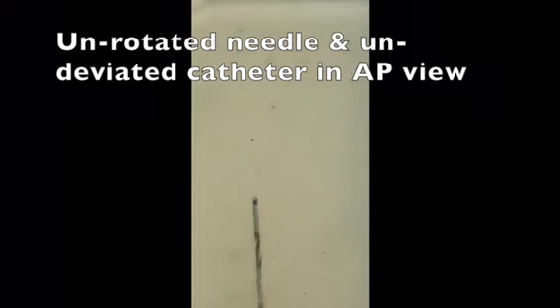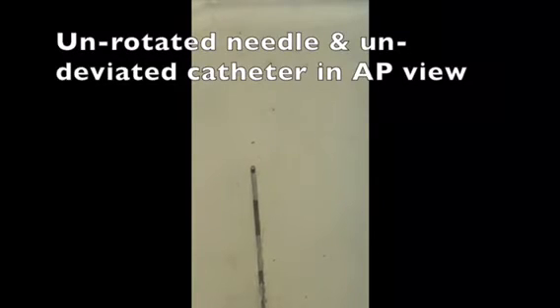I advance the epidural needle until I find the epidural space by using the technique of loss of resistance to normal saline. Then I use a total of 10 cc of normal saline to dilate the epidural space. Next, I put the catheter through the needle until there is some resistance. When the patient feels some pressure in the middle of the back, I advance the catheter into the epidural space by 4 centimeters, going straight forward.